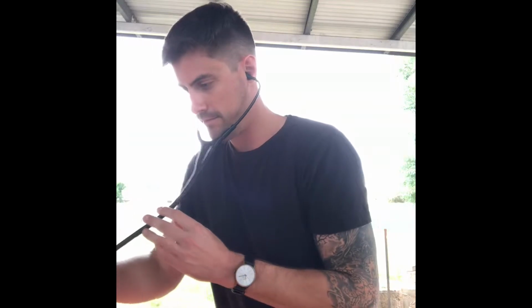Secondly, we're going to do a full baseline set of observations and a primary survey. We'll listen to all lung fields. And as I said, a full set of observations: blood pressure, oxygen saturations, cardiac monitor, temperature, BGL, respiratory rate, do it all. We're going to have the patient in a position of comfort, whether that's semi-Fowler's, high Fowler's or supine position, as long as the site is not being disrupted. We're going to do a pain assessment on the patient and deliver analgesia as required.